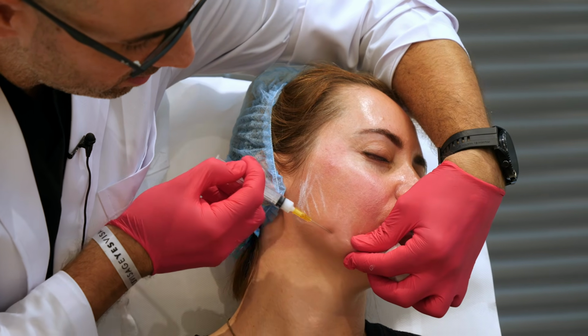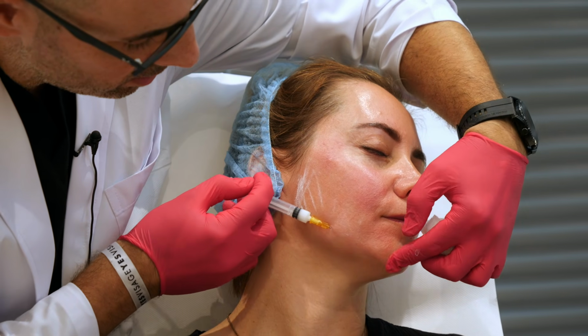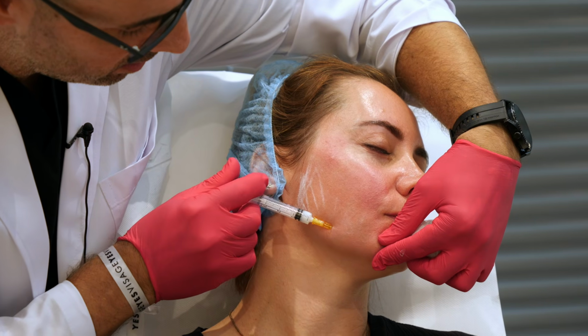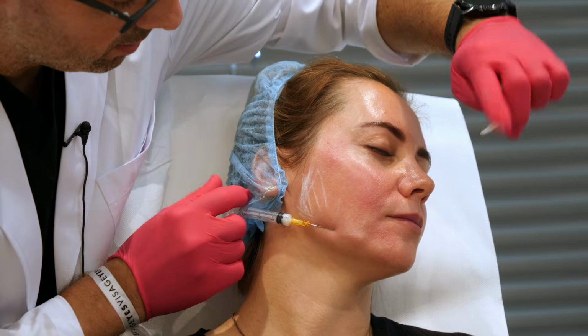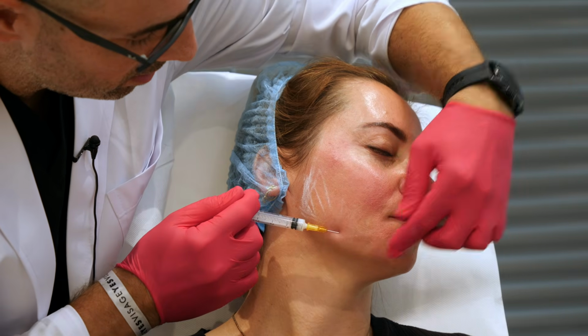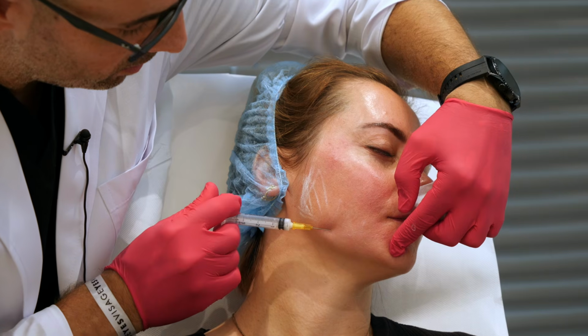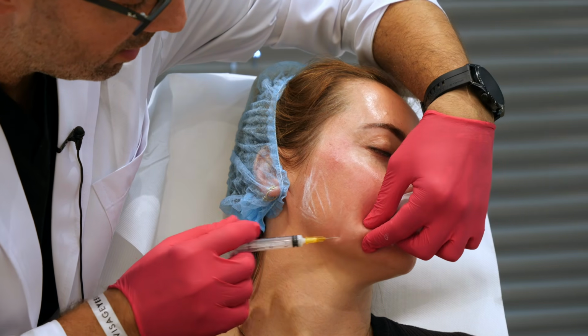And just on the bone line, make another vector, just stop here with the hand that helps you.